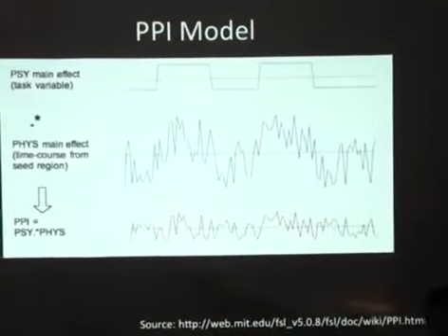Good so far? The next thing is actually running the GLM, which is where we do the most work. The script has already been done for you. Notice the only things I'm changing: I'm leaving in my visual and auditory task regressors and all my motion. The only things that have changed are the ROI time series, the physiological regressor, and the interaction terms for the ROI with each psychological regressor. Everything else is the same — motion regressors, t-statistics, design matrices, fit time series, error time series.